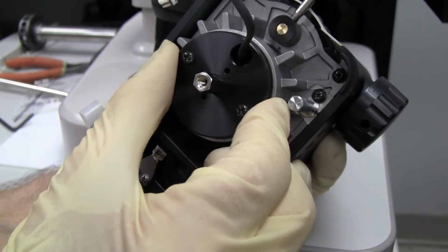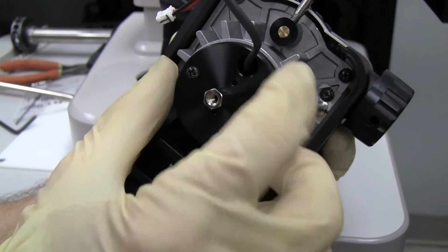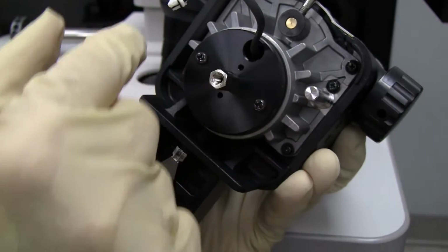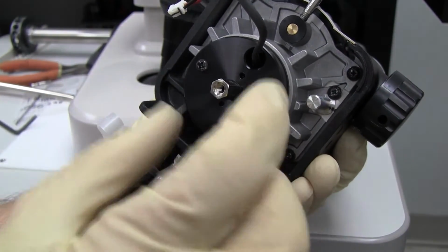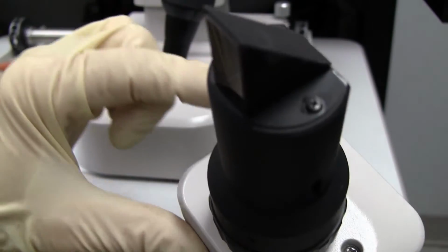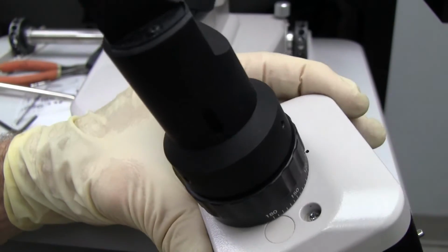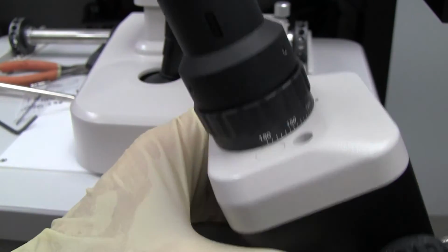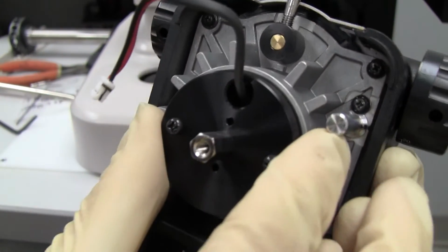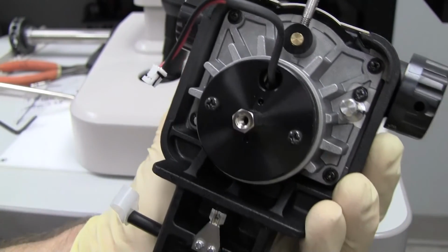And so if you were able to mark it before you took the 4 screws out, to get it as close to its original position, or not, try to center everything and tighten it up, and then we'll see. And later on, remember you can always do a lot of adjusting by these 2 screws, loosening these and turning this whole upper assembly, and you can get some very good alignment that way too. But we're going to try to center this assembly before we tighten up the 4 screws.